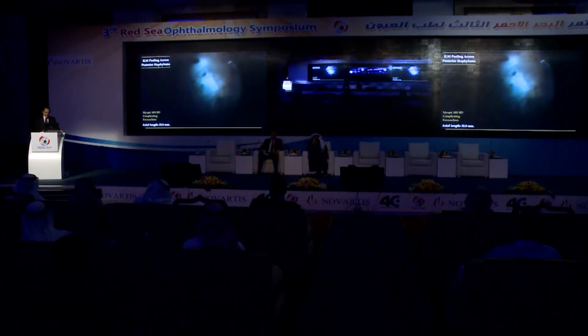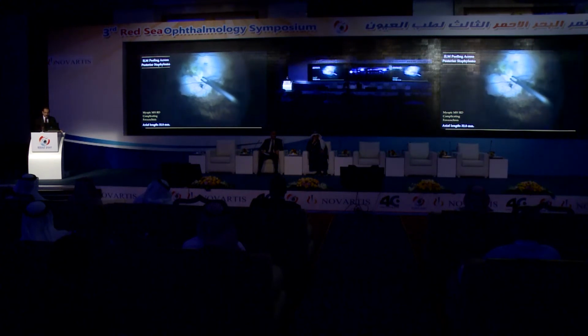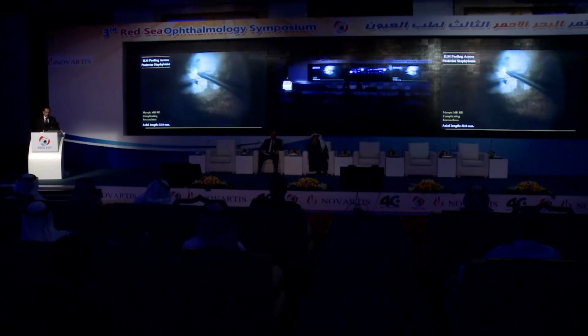But 6 months later, the macula became detached and the patient was complaining of distorted vision, and we decided to operate, removing the internal limiting membrane and, of course, the posterior hyaloid. And there was a peripheral break at the edge of the staphyloma. This is after the injection of brilliant peel and peeling of the internal limiting membrane cautiously.